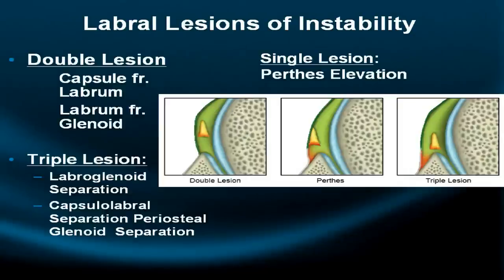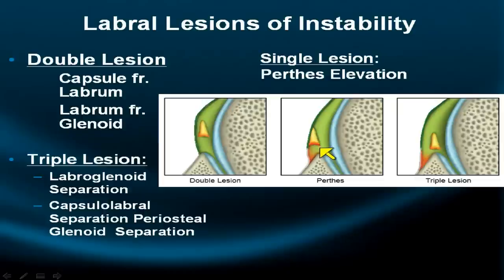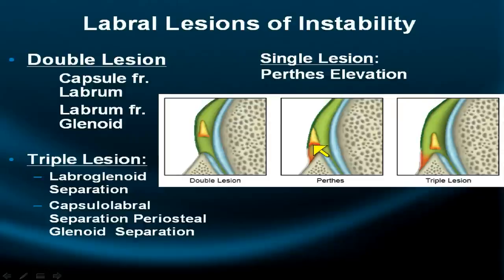Looking at Bankert equivalents: the Perthes lesion is where the labrum itself is intact but lifted away from the glenoid, forming a space or pouch. The periosteum swells and peels away from the scapula but is not broken, creating a closed space in which fluid, mucoid tissue, and blood may accumulate — the Perthes pouch. When this occurs posteriorly, it is called a reverse Perthes or Kim's lesion. These shoulders may or may not be unstable.